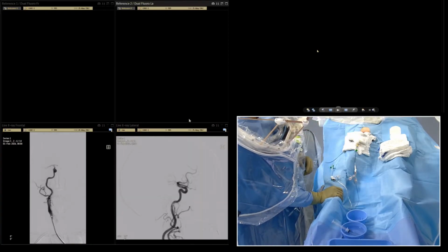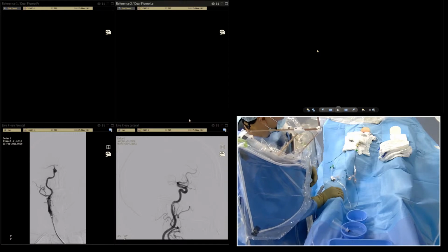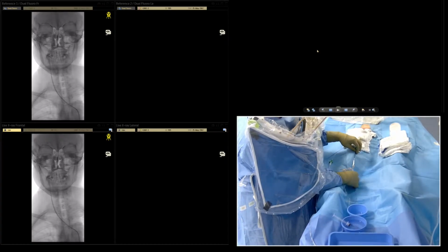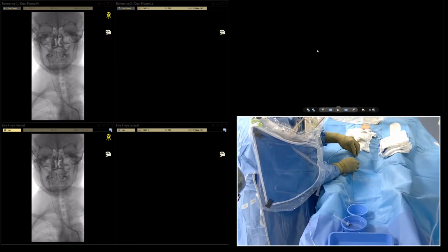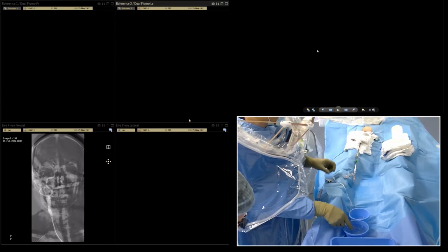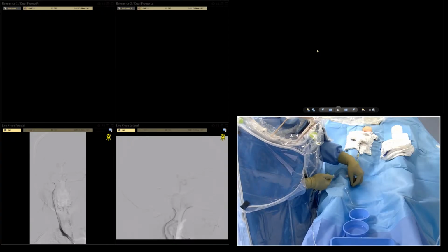He's our teacher, the teacher of Kazakh interventional endovascular neurosurgery, and we learned diagnostic angios in that manner. We are doing it with the guiding catheter, which is now 6 French.